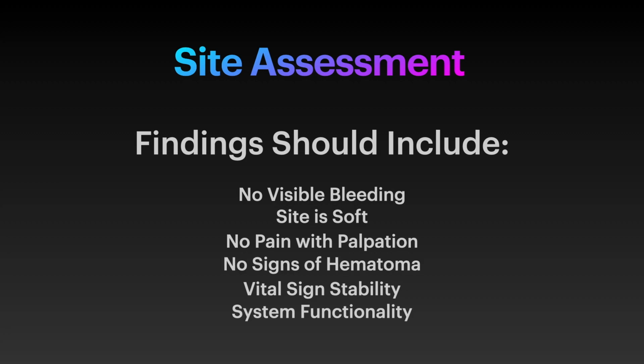We want to ensure the patient's vital signs are stable. Lastly, we will make sure the system is functioning appropriately. All stopcocks are off in the correct position, there is adequate pressure on the pressure bag, and we have 0.9% normal saline within our pressure bag. We won't go into too much detail about system functionality and waveform readings until you have covered that process in lecture.